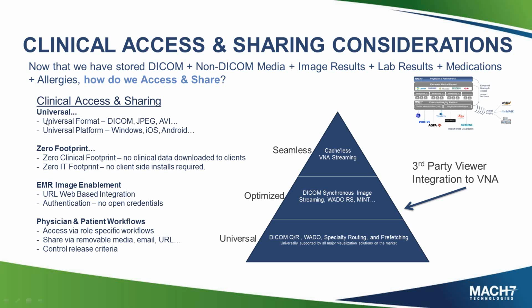A couple of things I would highlight. When you're looking at VNAs and if you're looking for vendors to stream off of your VNA, look at, the standard today, you want a universal viewer and you want it zero footprint. I like to educate a little bit on what it really is to be universal. To me, there are two flavors of universal. There's universal format. Does that viewer support displaying DICOM as well as JPEGs and AVI files and MPEGs and so forth? But also there's a universal platform. So does it work on Windows? Does it work on your iPhone and iPad or your Android device? So two flavors of universal there, both universal format and universal platform.